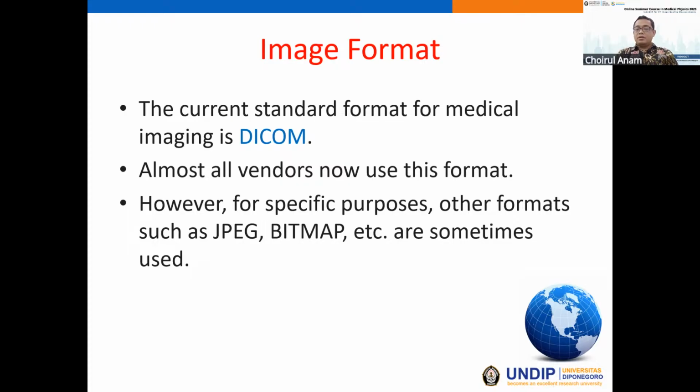However, for specific purposes, other formats such as JPEG and bitmap are sometimes still used, for example for giving information to the patient or for printing. But for communication and storing systems, all hospitals use the DICOM format.